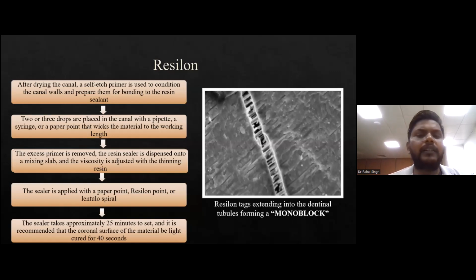But in my practice and in a variety of cases I have seen, your last irrigant should be NaCl only. We don't want any other chemical to be there in the canal. You use copiously your hypo and EDTA, 15% EDTA, 5% sodium hypochlorite, depending on the case. But yes, your last irrigant should be NaCl only.